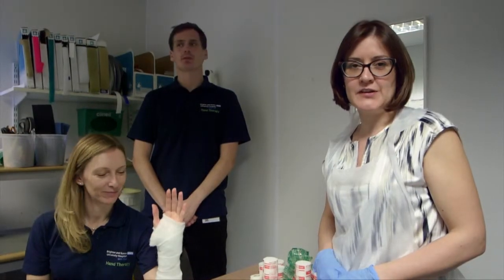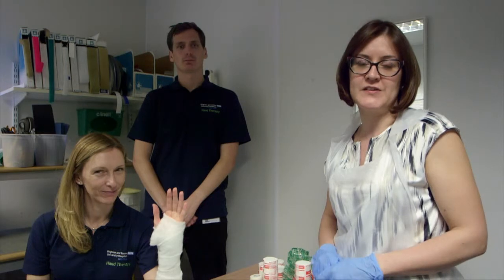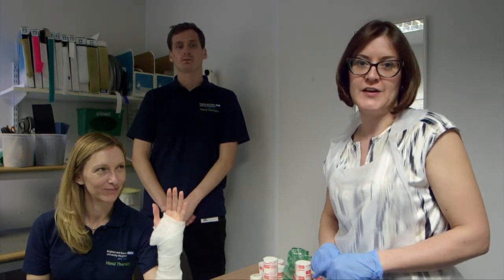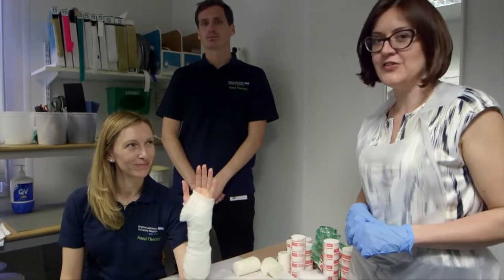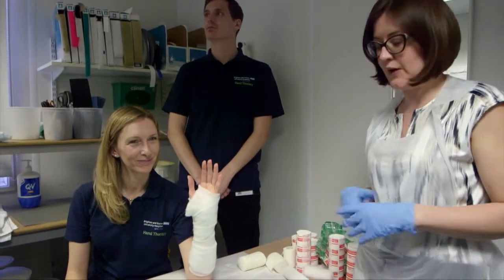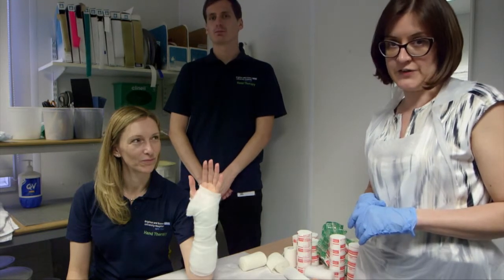Hello, my name is Laura Hamilton. I'm a consultant trauma and orthopaedic surgeon in the hand department of the Brighton and Sussex University Hospital Trust in the south of England. I have here our lead hand therapist Penny Stewart and we're going to show you a simple technique for application of a dorsal back slab for distal radius fractures.